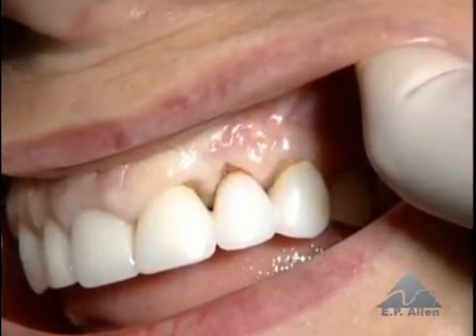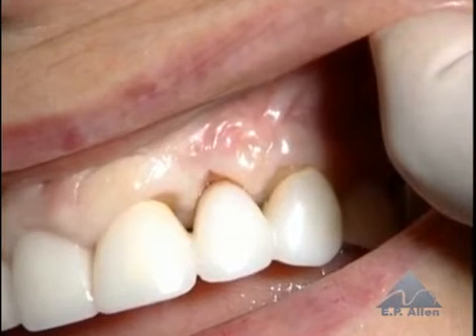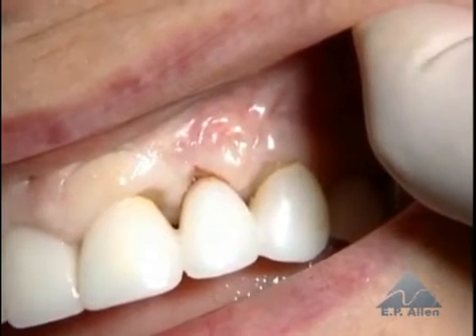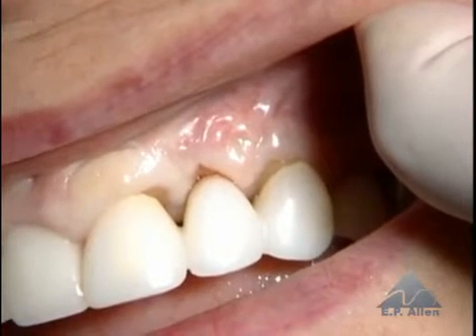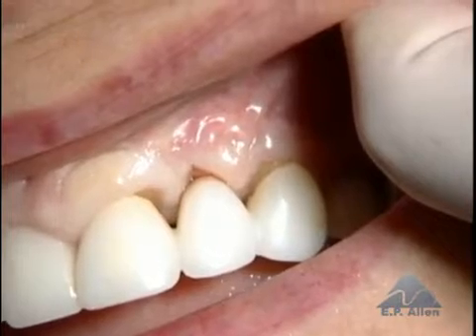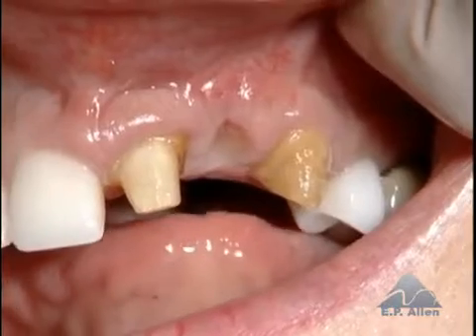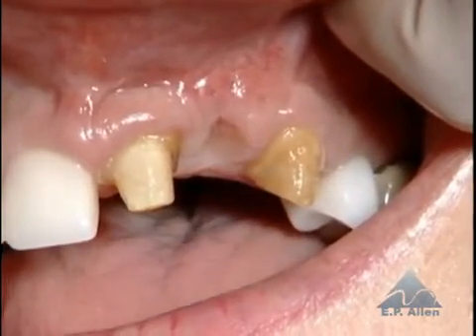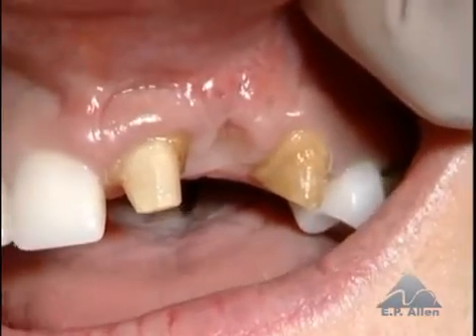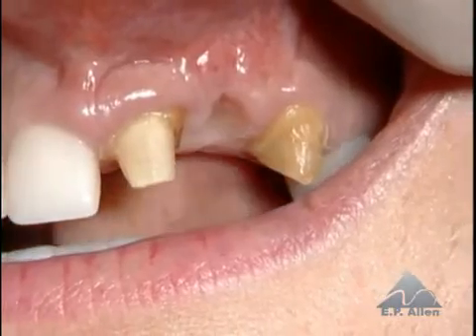In this view, you can see the papillary loss a little bit better, and also the root exposure on the proximal surface of the central incisor. So that is an area we'd like to elevate the papilla into that embrasure space that's been created in this provisional restoration. Now we have cleaned the cement from the teeth and flossed, and what we'll do next is assess the site to see what we wish to do.